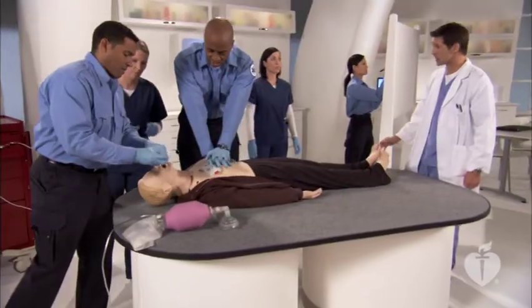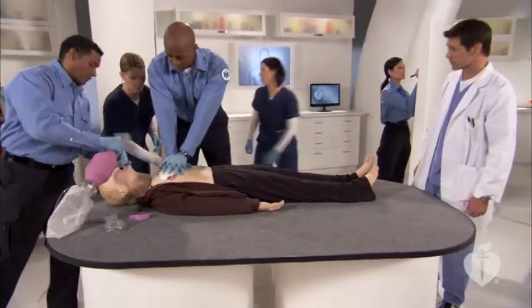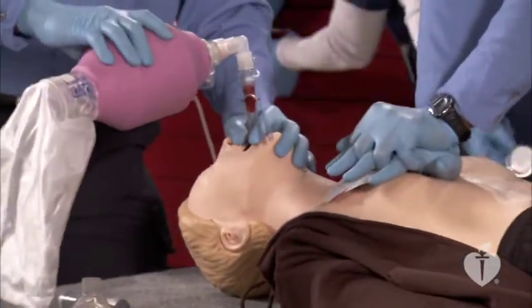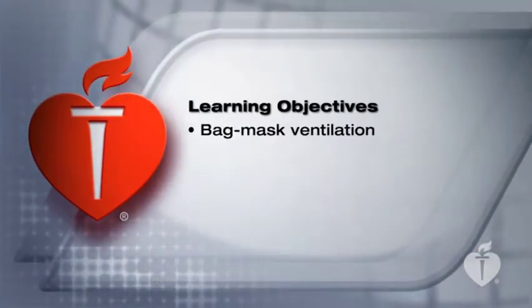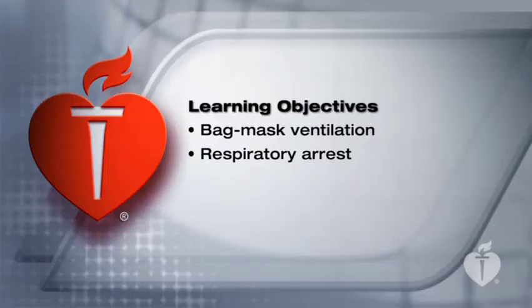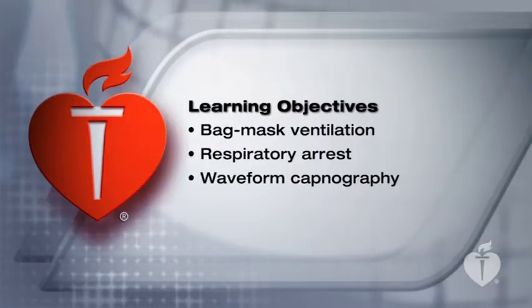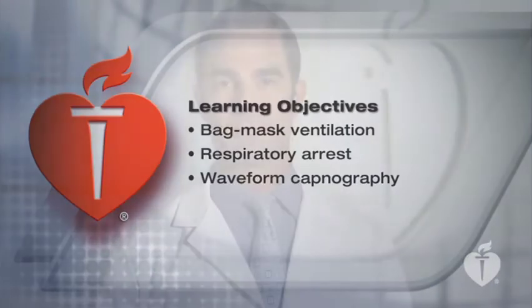The optimal method of managing the airway will vary based on provider experience, EMS or healthcare system characteristics, and the patient's condition. The skills you will practice in this section of the course are essential to complete the ACLS case scenarios and testing. We'll review and practice effective bag mask ventilation in both single rescuer and two rescuer scenarios. We'll review the steps in responding to a respiratory arrest and the recommended use of waveform capnography to monitor and confirm the placement of an endotracheal tube.